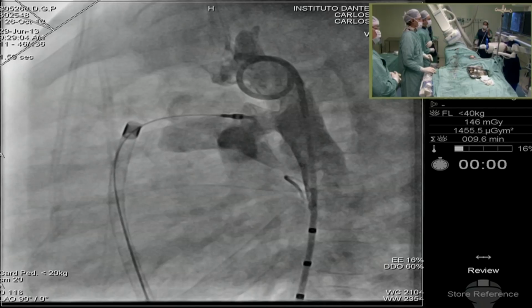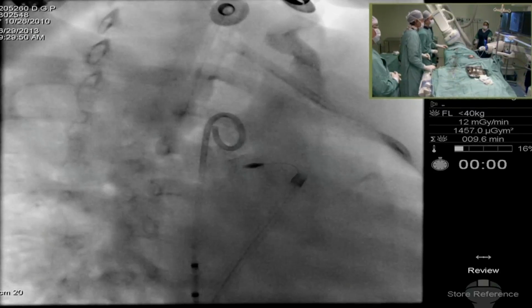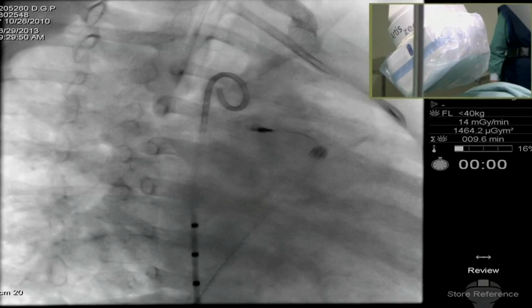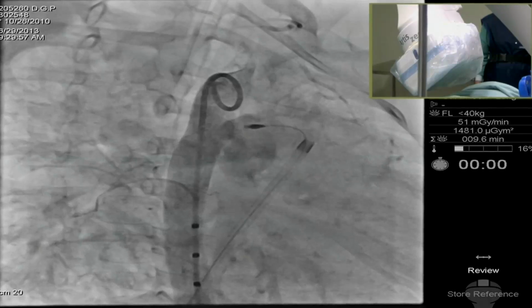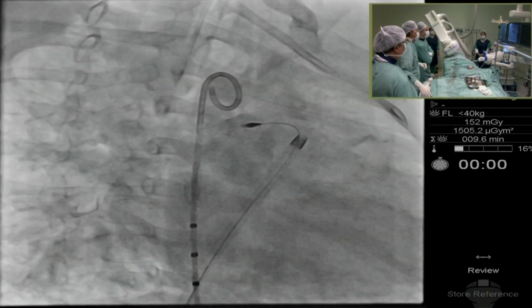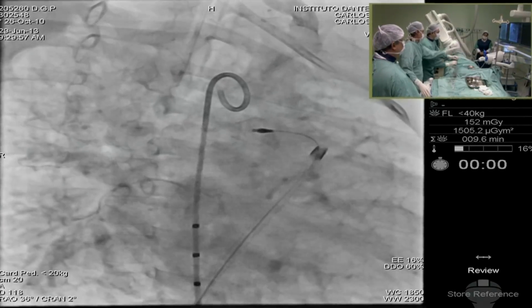The problem there is that if the device is constrained, even if you use a balloon, it will go back to the shape that it's taken. Also note you have a lot of pull on the device, so when it's let go, it'll go back. It is going to push out even more. Yeah, I think it's a little too big.